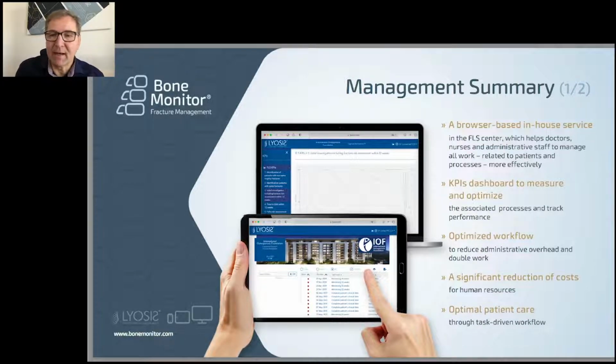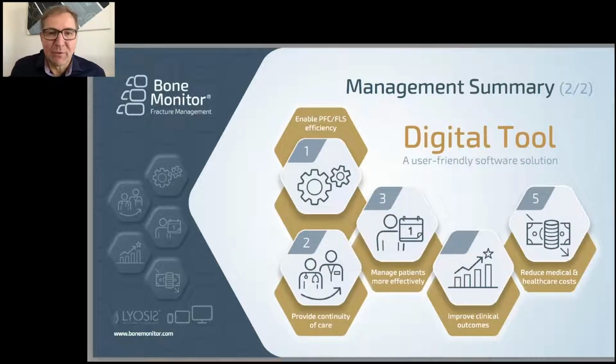We are providing a KPI dashboard to measure and optimize all related and associated processes and tasks to optimize your workflow and reduce administrative overhead and double work. That leads to a significant reduction of cost for human resources and gives you optimal patient care through our task-driven workflow. That means it helps you to enable PFC FLS efficiency, to provide continuity of care, to manage patients more effectively, to improve clinical outcomes and reduce medical and healthcare costs.